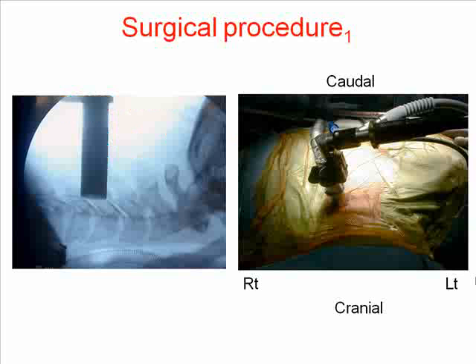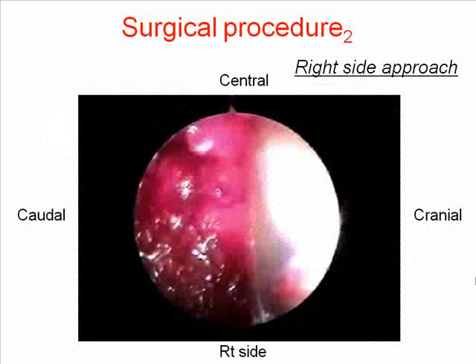The patient was secured in the Mayfield head holder and placed in the prone position. A 20 mm incision was made 20 mm off the midline. A tubular retractor with 18 mm diameter was used. The best trajectory was slightly inclined from horizontal orientation. The endoscopic procedure is shown.